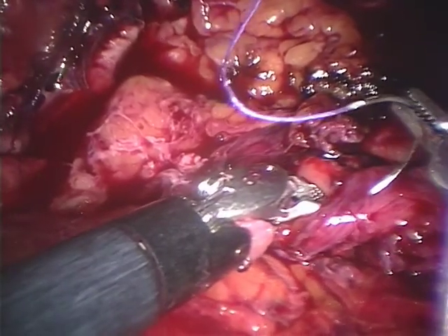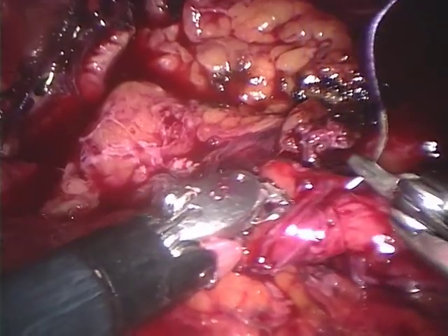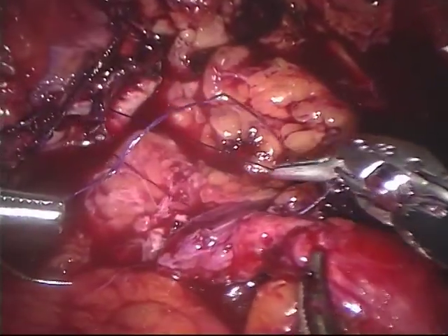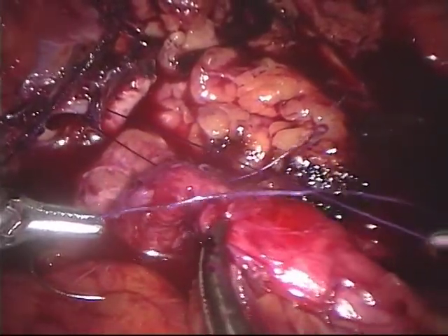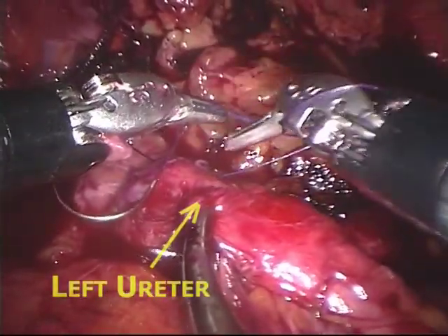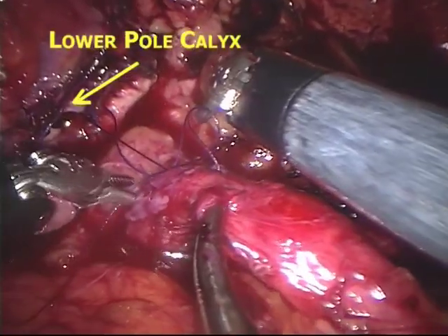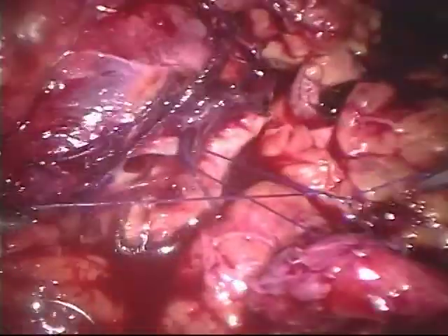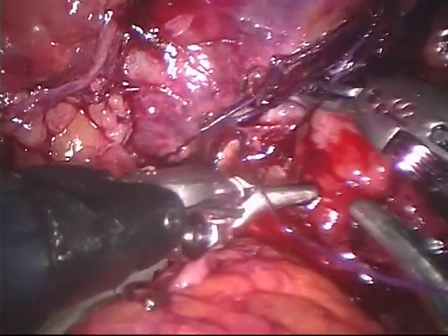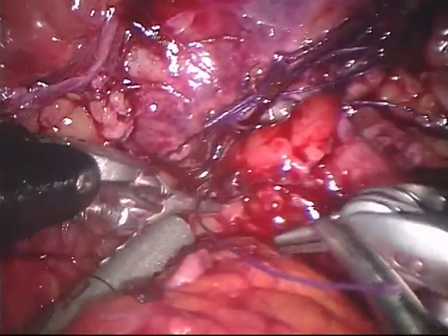Now the anastomosis is performed with a 3-0 Vicryl suture on an RB1 needle. An apical suture is placed in the lateral ureter and then in the three o'clock position in the open lower pole calyx. The assistant holds the ureter close to the calyx, keeping it off tension to help allow for a tension-free anastomosis. Next, a posterior suture is placed, again using a 3-0 Vicryl suture on an RB1.